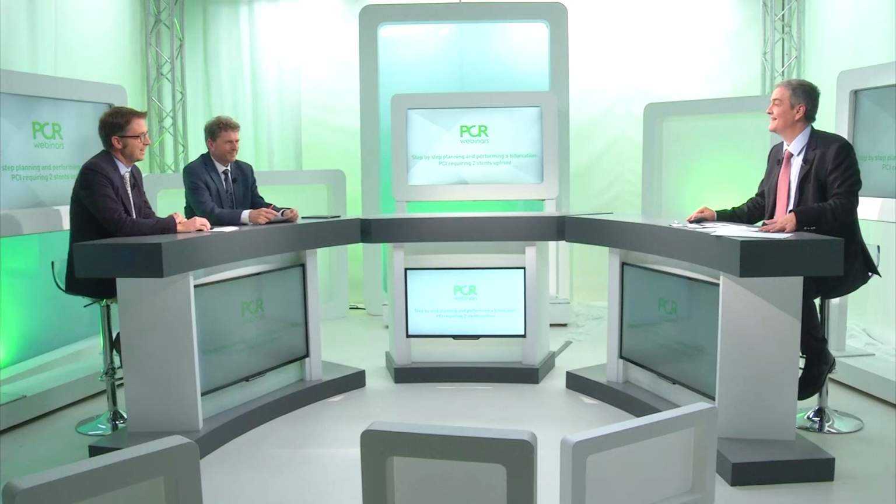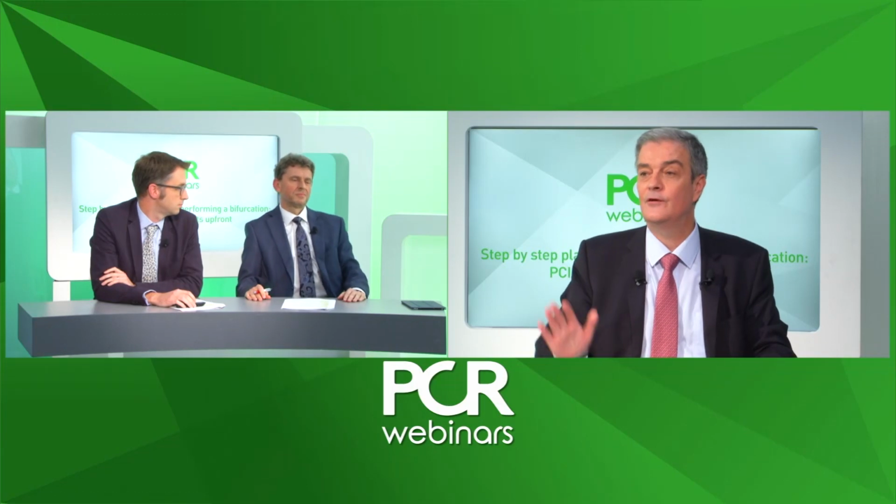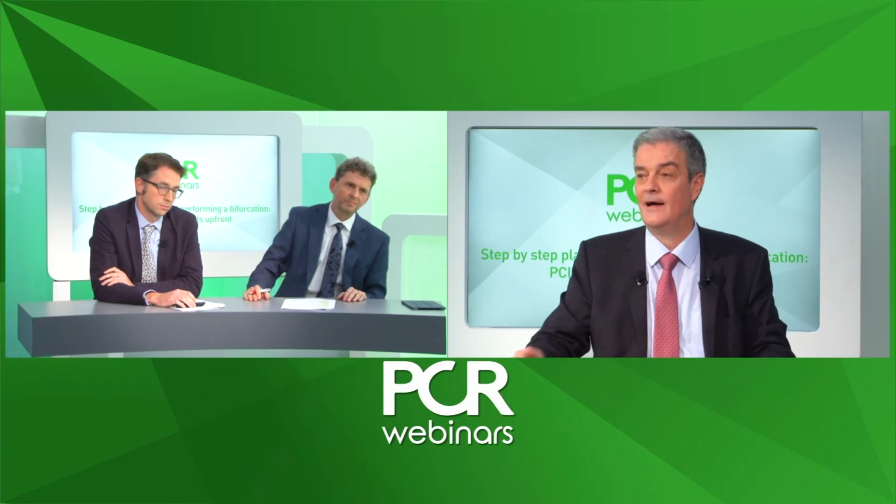I'm very happy to sit here and ask questions instead of answering these difficult questions. At every seminar there is a question, should we do POT before exchanging wires? Why don't we exchange and then do POT? I think you answered quite nicely that the main idea is first expand. Otherwise, you will never see if it goes in and out or completely behind the stent.